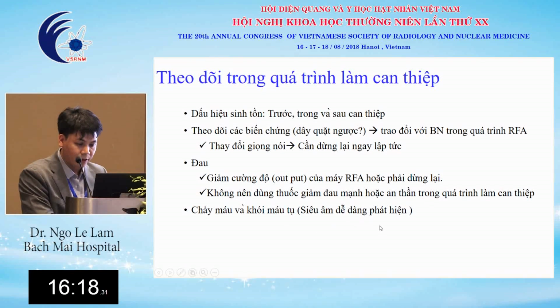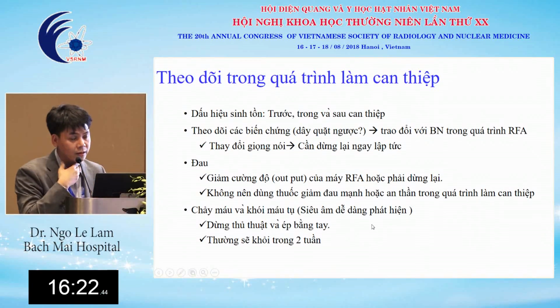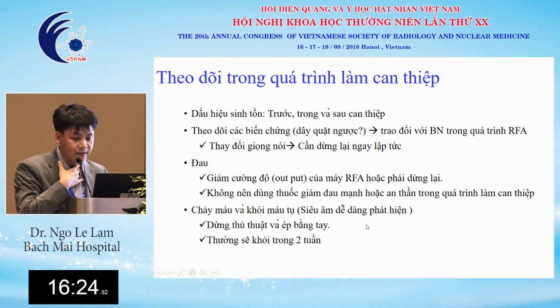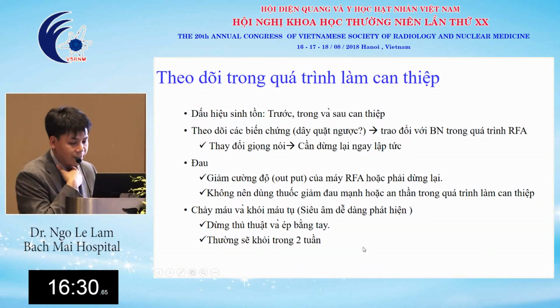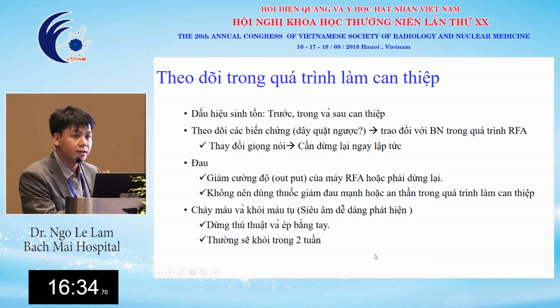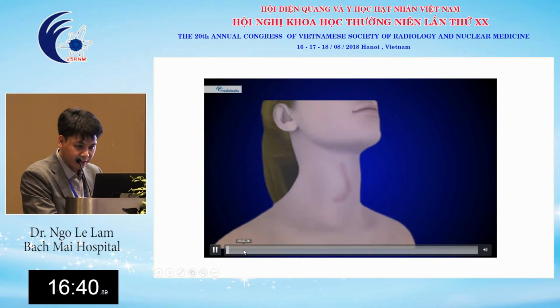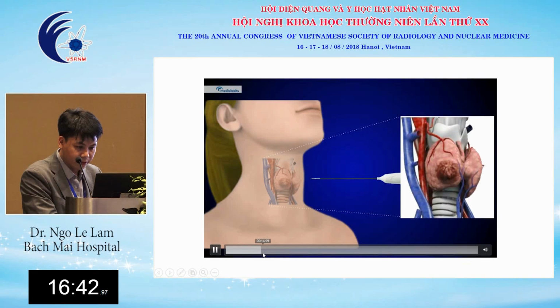For hemorrhage and hematoma, it's easy to detect by ultrasound. It's not too hard to control. We just stop the procedure and apply the compression. Normally the hematoma will be resolved after 2 weeks. This is the video to see how the procedures can be done.